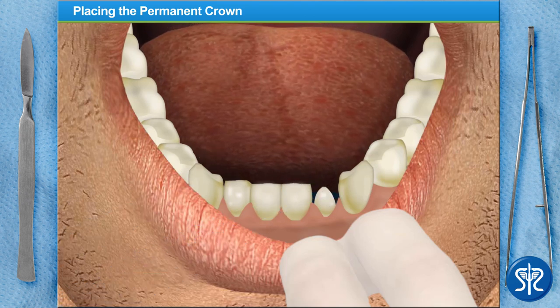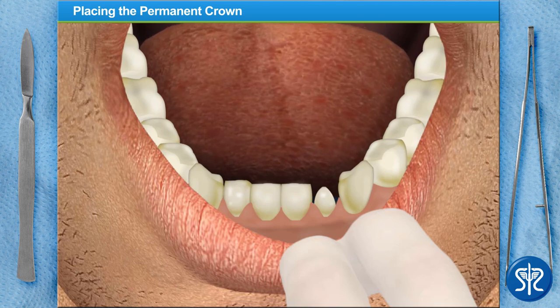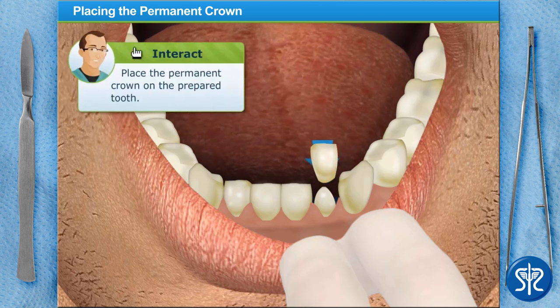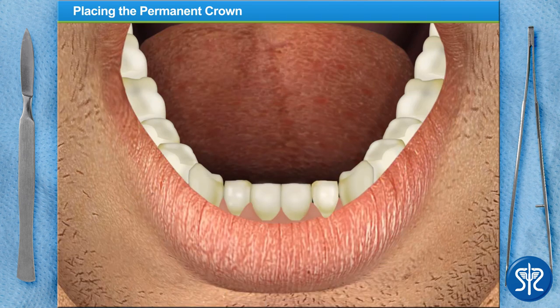I've already checked the fit and color of the permanent crown and everything seems great. I've applied cement on the inside of the crown, so it's ready for you to place. Perfect — after the cement has hardened, the dentist would check the fit of the crown again and the patient's bite to ensure there are no issues.